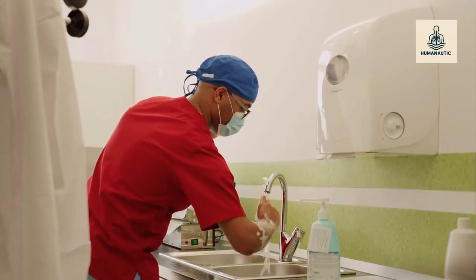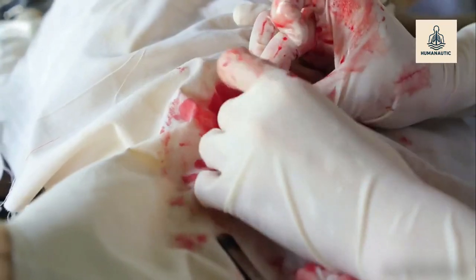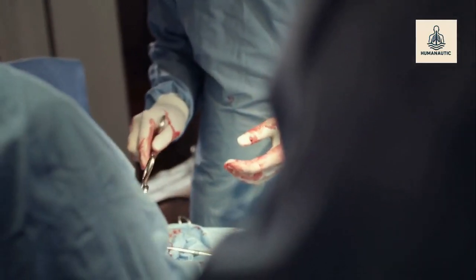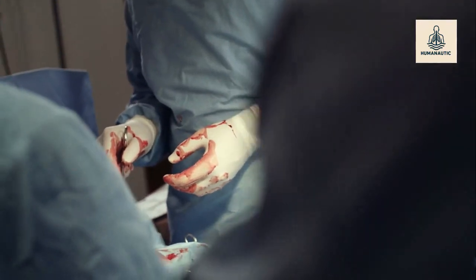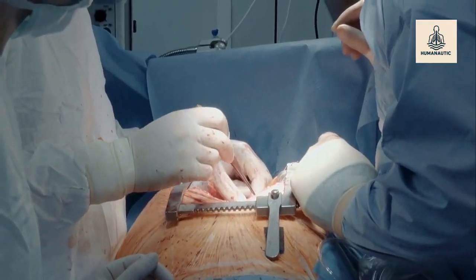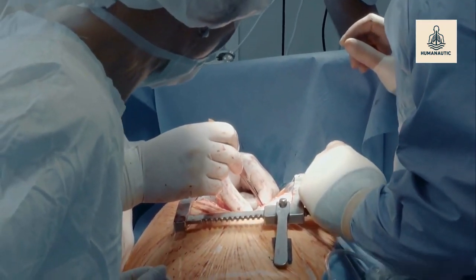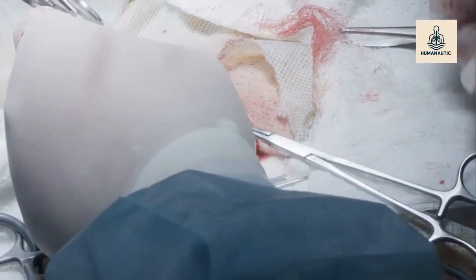5. Open hemorrhoidectomy, Milligan-Morgan technique. This is the most commonly performed hemorrhoidectomy technique. First, the hemorrhoidal tissue is grasped using artery forceps or Alice forceps to provide traction. Next, a V-shaped incision is made over the hemorrhoid using a scalpel or electrocautery. The hemorrhoidal tissue is then carefully dissected away from the underlying internal sphincter muscle.